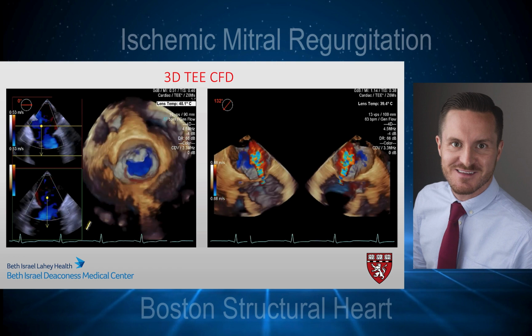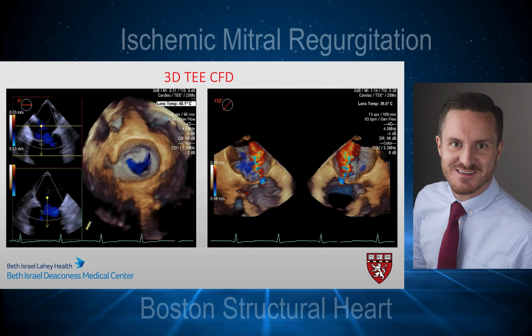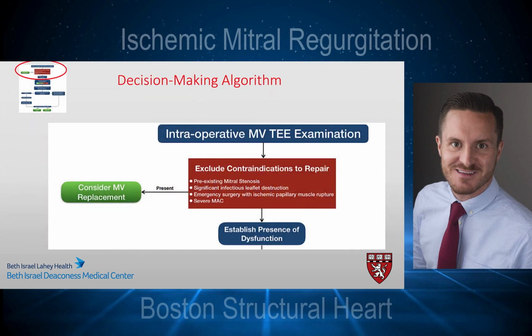3D imaging of this valve again confirmed our findings of significant mitral regurgitation with a large central jet. So looking at our decision-making algorithm, we can see that there is no immediate contraindications to repair in this patient, and we have clearly identified the presence of dysfunction.